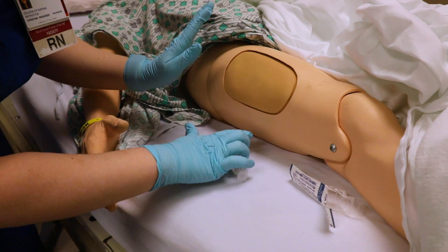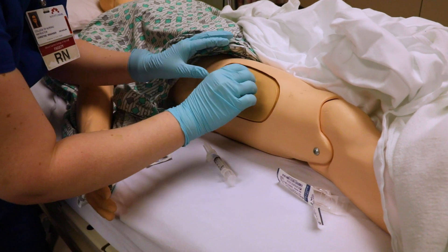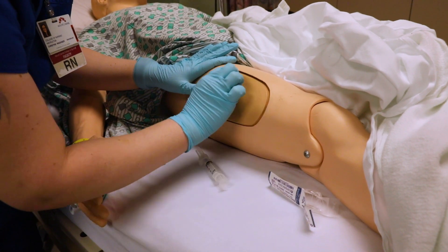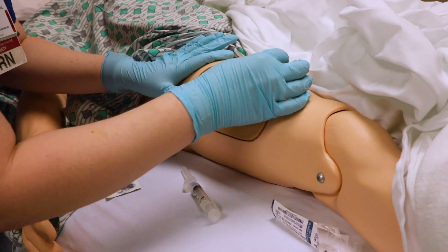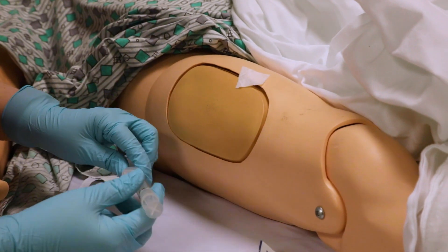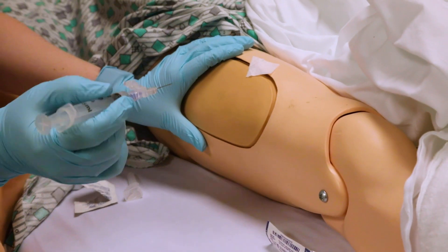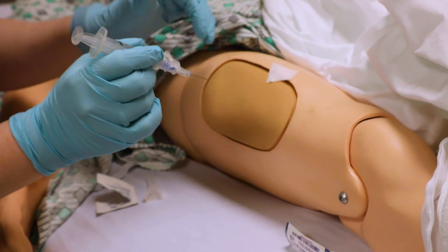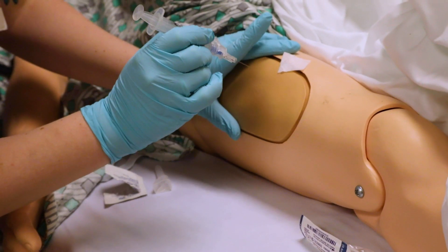Looking at my landmarks, we're going to go into that top third. You want to clean the area thoroughly — follow your facility policy, cleaning for about 30 seconds or so. I like to leave my alcohol swab there because it helps guide where I'm going to inject. Make sure you look at your patient; to reach the muscle you need to get farther in. So assess how big your patient is — for this patient, we're going to go at 90 degrees. It can be adjusted if your patient is extremely small.